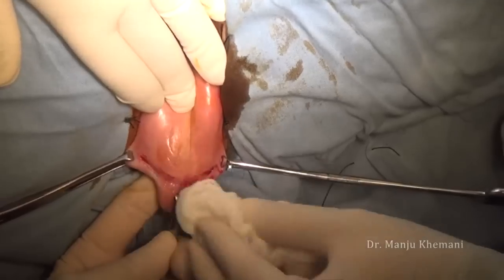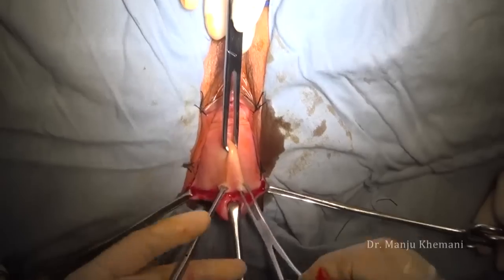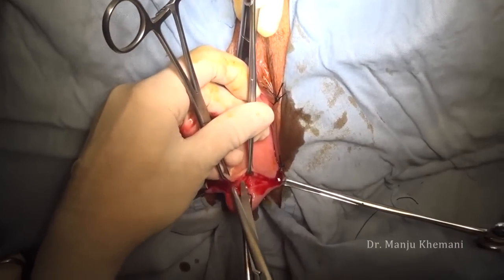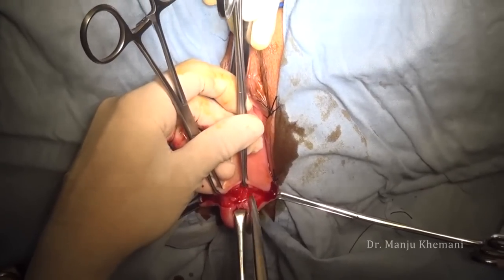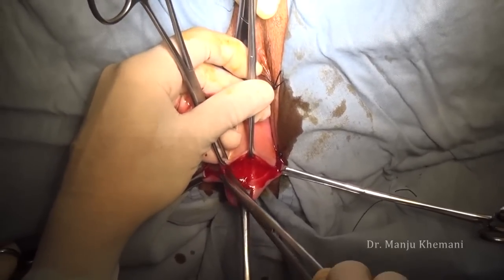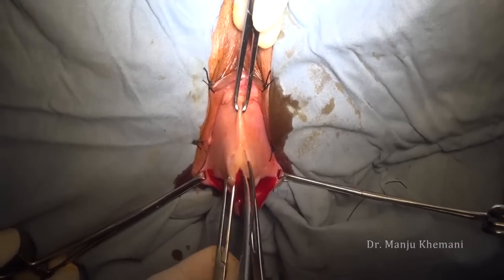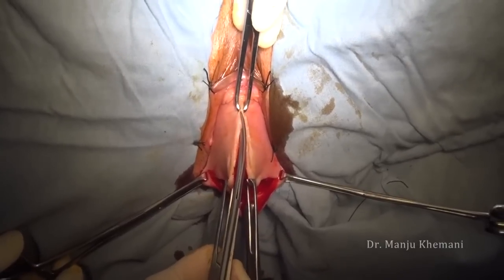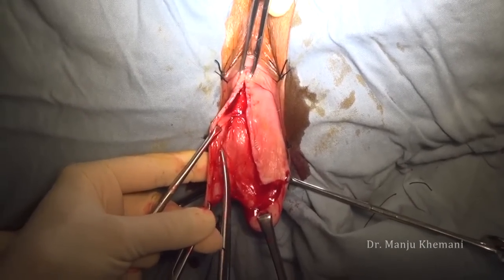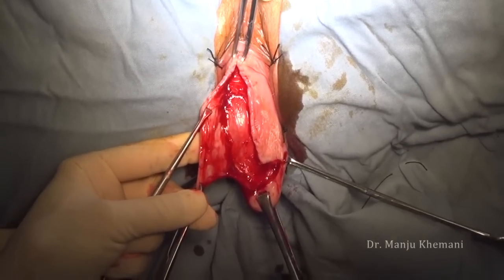I don't use anything because if you are in the correct plane, bleeding will be less. Once you have given the incision, the next step is to find the correct vesicovaginal space and separate the bladder from the vagina. Here with the scissors I am trying to find the correct space. The vagina is separated from the bladder using scissors — if you are in the correct plane, there is no bleeding.